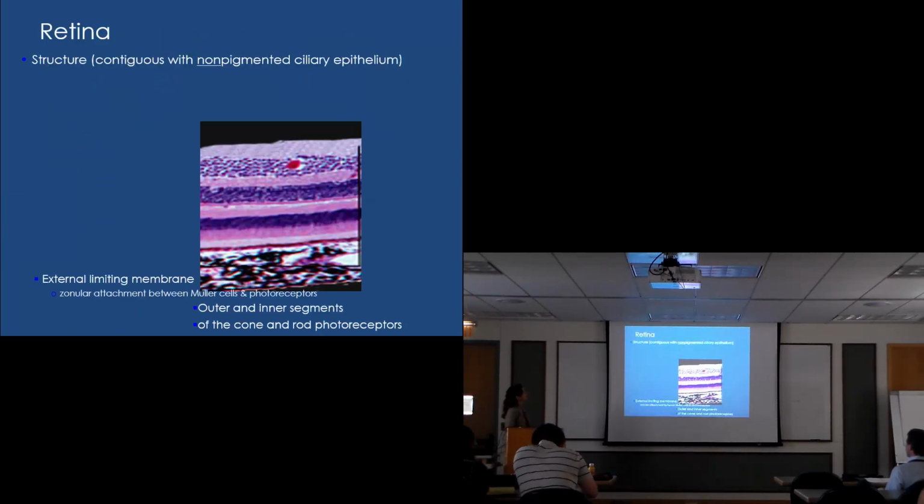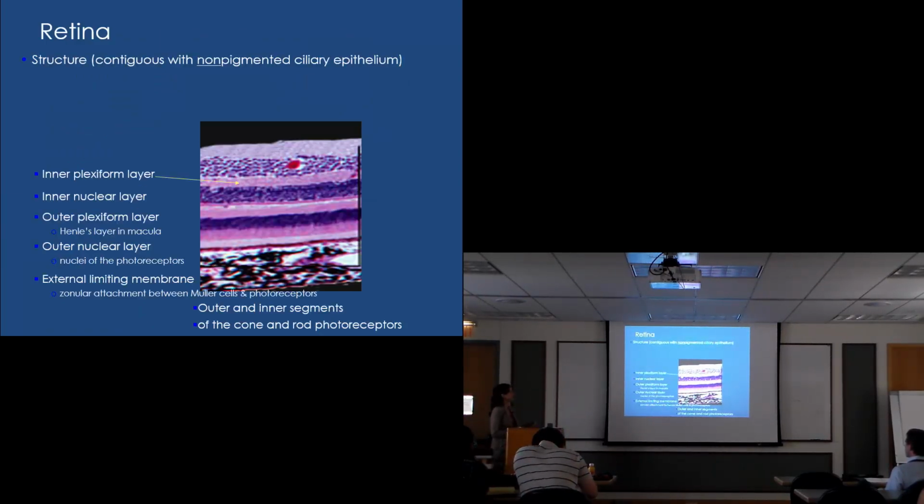Okay, so structure of the retina, just to take a step back, and this is why, as you can see from the spectral domain striations, this is what we see histologically as well. So the bands of the retina become important to us. This is how we learn it clinically. And this is the histological slide that people were using to analyze disease, obviously post-mortem or post-enucleation from the eye, and now we get this histological view in real time, which is totally revolutionizing ophthalmology, like we said.